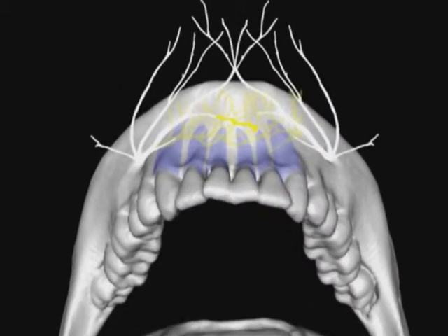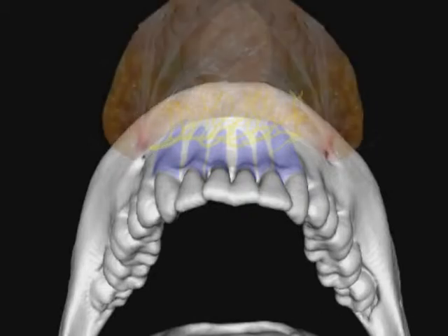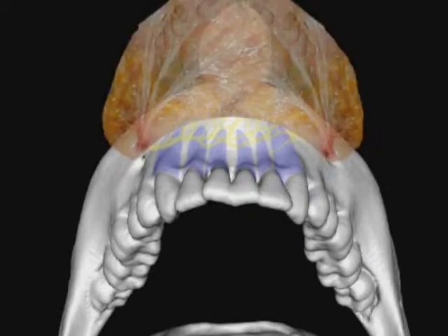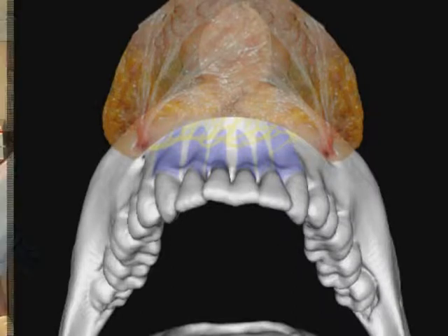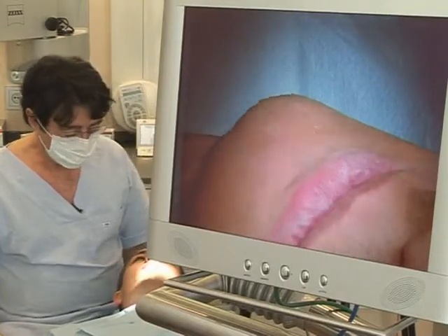In cases where rapid treatment is required, you could dispense with this technique and use intraosseous anesthesia instead. However, it is a suitable technique in surgical situations if a bone chin graft is required or when excising a cyst in the chin region.